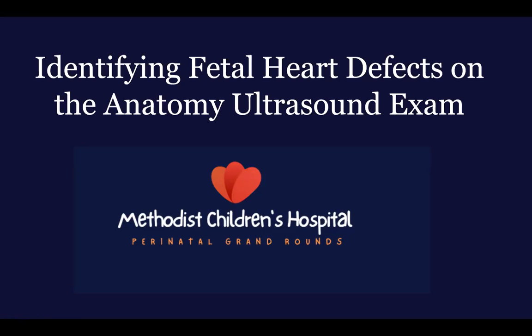Okay, welcome everyone to Methodist Children's Hospital's first perinatal cardiology grand rounds. Today we will talk about identifying fetal heart defects on the anatomy ultrasound exam.